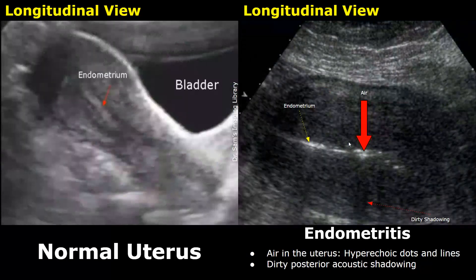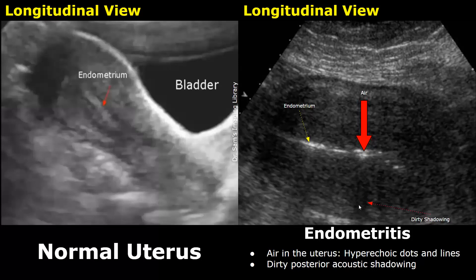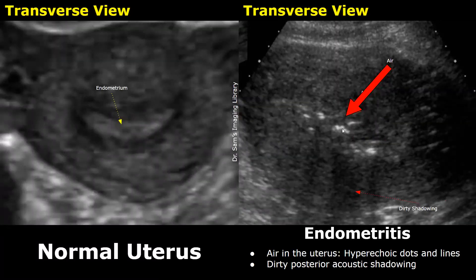Air in the uterus may also be present in some cases of endometritis. Air in the uterus appears as hyperechoic dots and hyperechoic lines with dirty posterior shadowing. A dirty shadow appears gray instead of jet black — it is not as prominent as a clean black shadow seen behind dense structures. Here is another image showing air in the uterus: hyperechoic dots with dirty grayish posterior acoustic shadowing are seen in a case of endometritis.